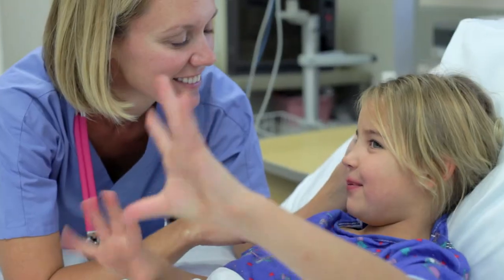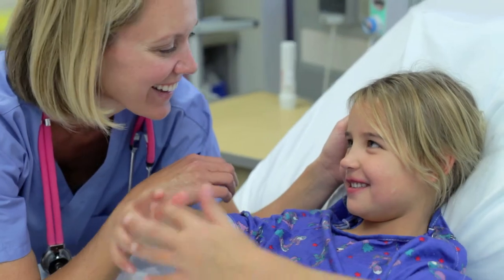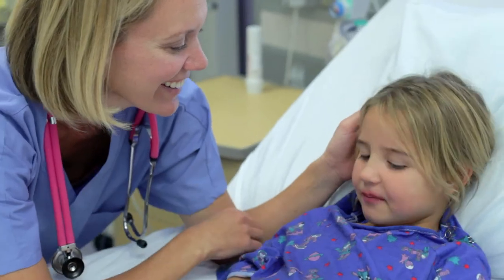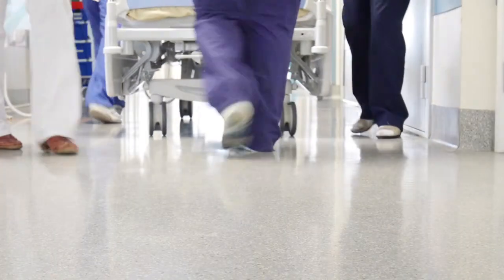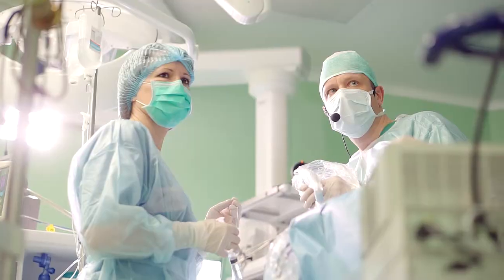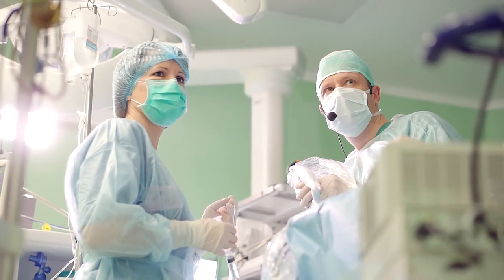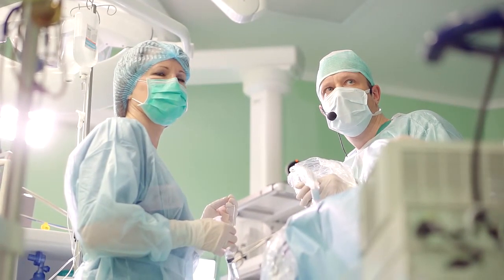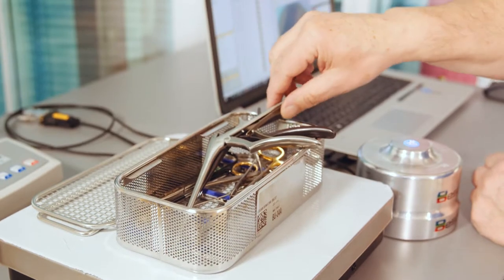The increase of surgical procedures and growing range of surgical instruments require an accurate, fast, and intelligent solution.